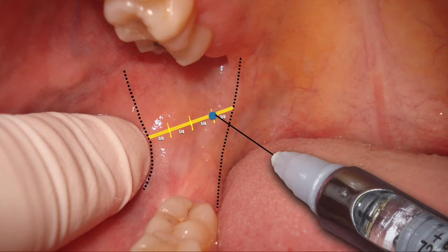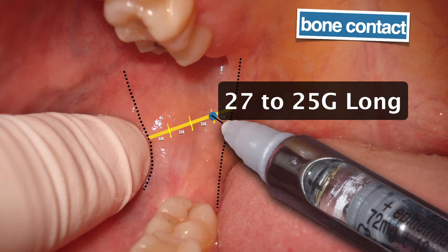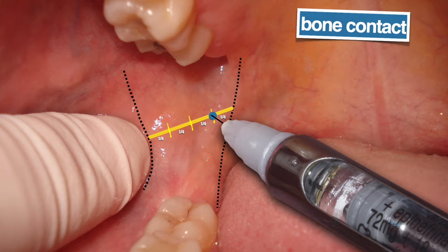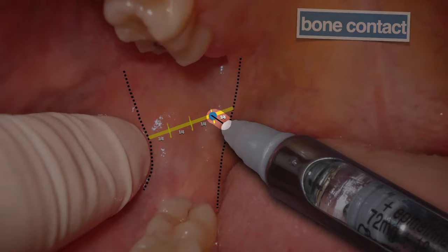The next step is to insert the needle into the target area until you feel a kind of bone resistance. It is important not to force the needle against the bone, as you could damage the needle bevel. The needle needs to be 25 or 27 gauge, long. The needle is inserted almost entirely — a small segment of the needle usually remains outside of the oral tissues, which is desirable.